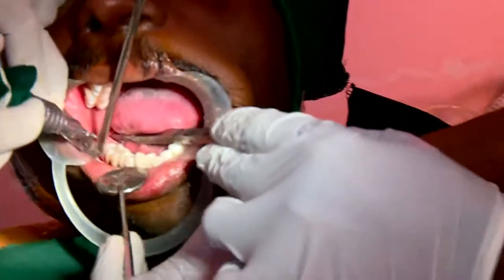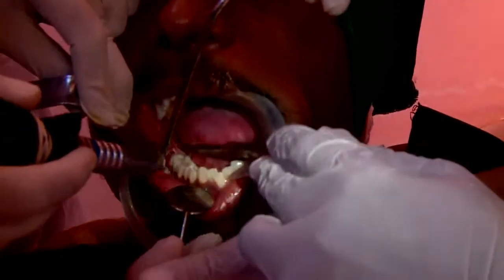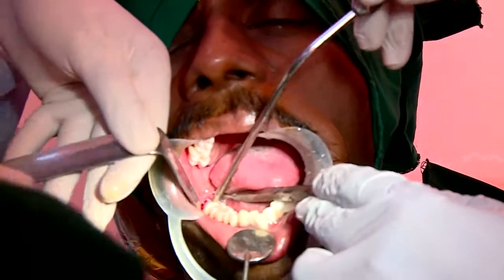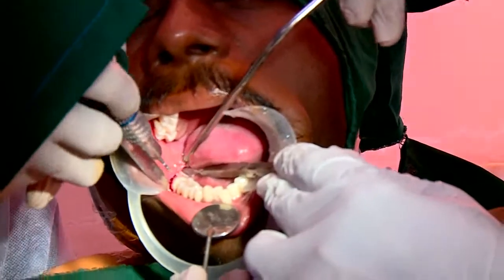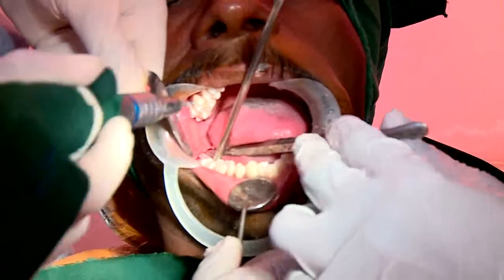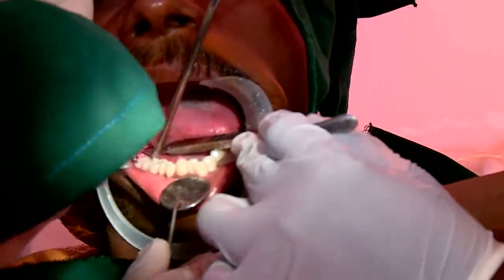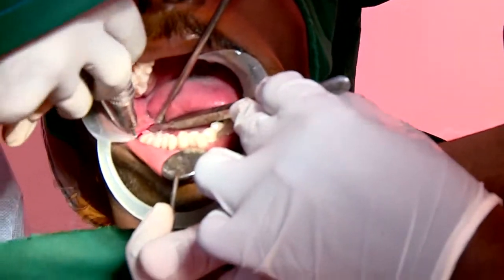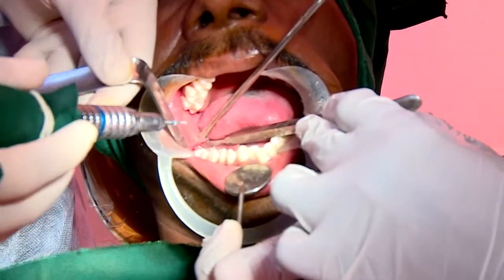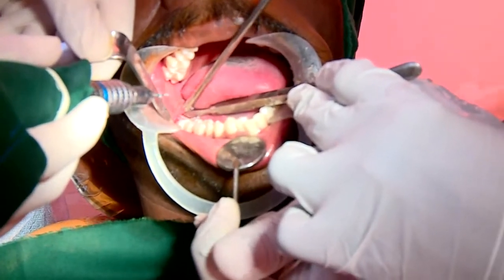It won't come out. So the top portion will be a little larger than what is below. That's why sir is splitting a little obliquely. Always use lots of irrigation.